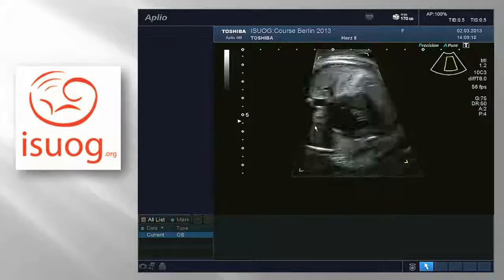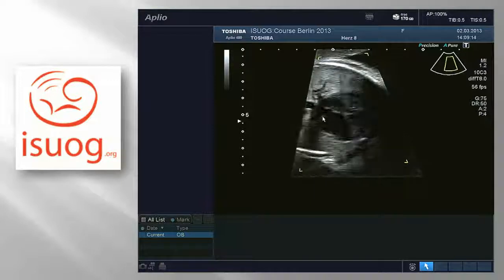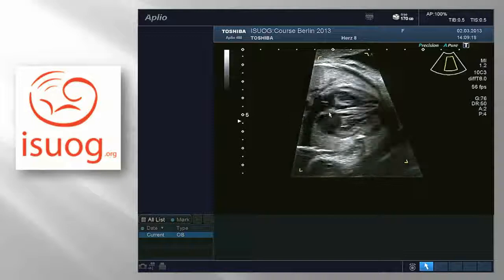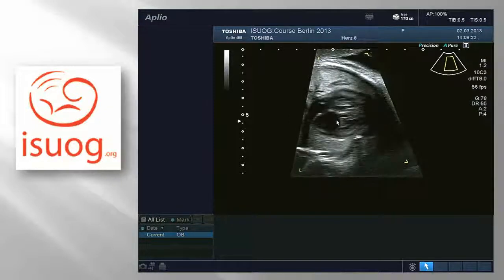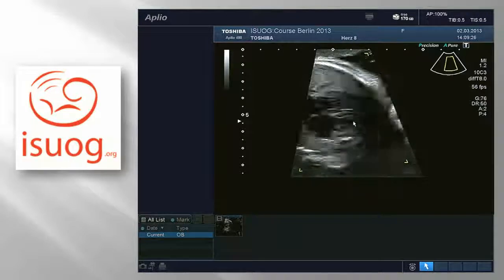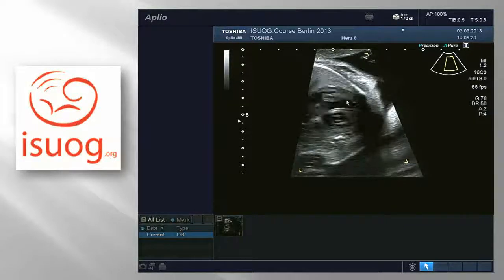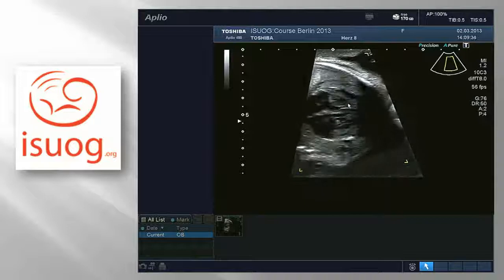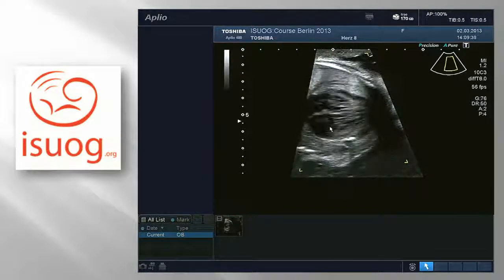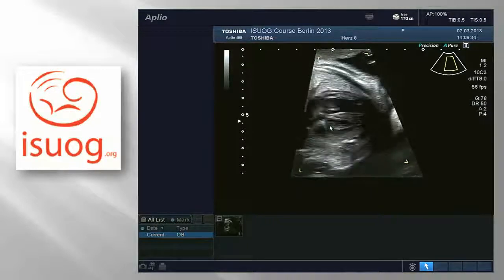Just need to adjust a little bit to get rid of the shadowing. One coming from the right lung. The flap valve of the foramen ovale. The foramen ovale itself is wide open. We see two valves with the normal offset. We see the moderator band coming across the right ventricle and a smooth apical portion of the left ventricle. Valves open and close normally. And then a very slight tilt of the transducer, and I stop here.